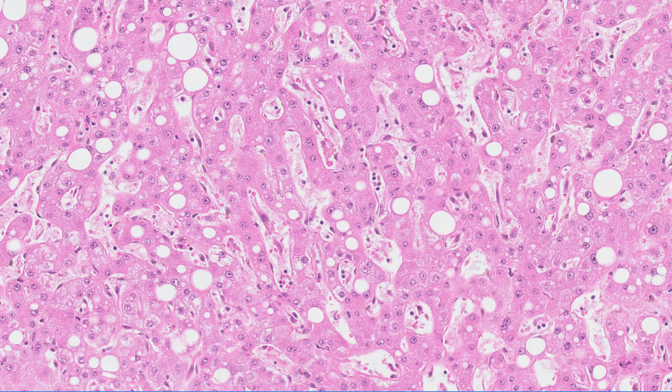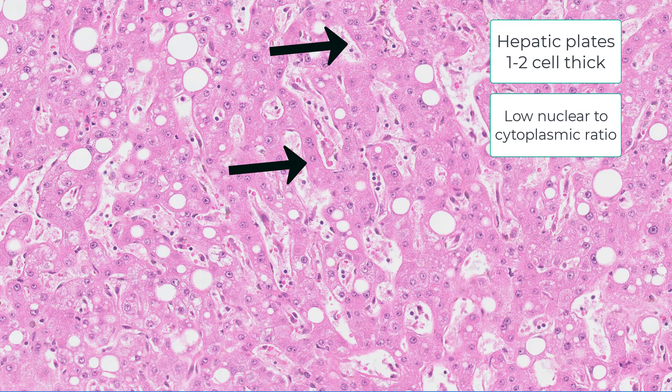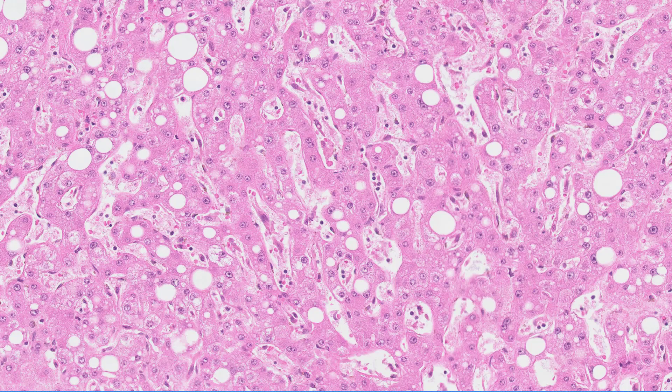I want you to pay attention to these little blue balls that are scattered all throughout the lesion. The first thing you need to decide when you see one of these lesions is: is the liver benign or is the liver malignant? There's an entirely different talk that covers benign versus malignant liver, but for the sake of this discussion, the plates are one cell thick, there's no atypia, there's a low nuclear-to-cytoplasmic ratio, and there is no mitotic activity. This is benign.